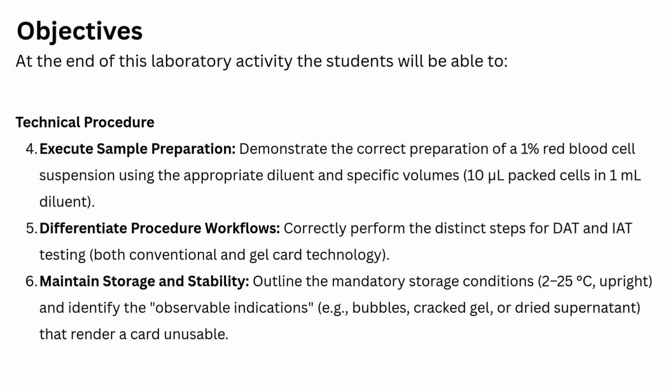And then maintain storage and stability. So by outlining the mandatory storage conditions, 2 to 25 degrees Celsius upright, and identify the observable indications, so like bubbles, cracked gel, or dried supernatant, which all of them render the card unusable. So whenever you can see bubbles in the card, or the gel inside the card, the gels are cracked, or the supernatant gets dried, then the card will be considered unusable.